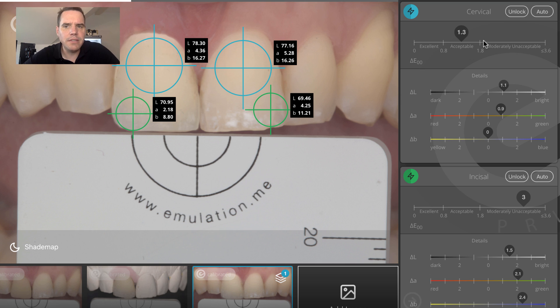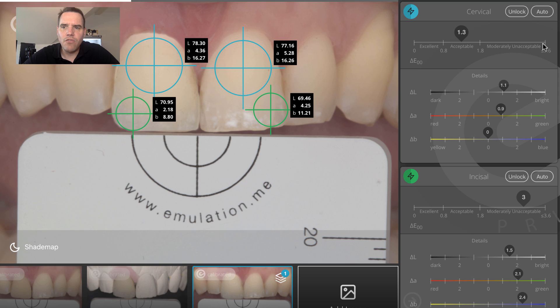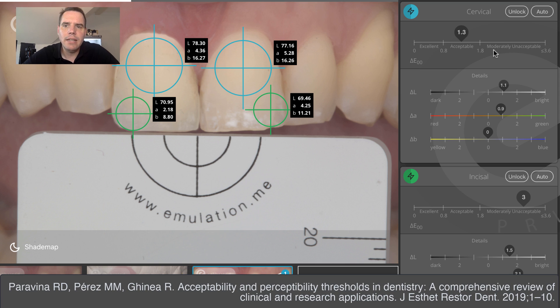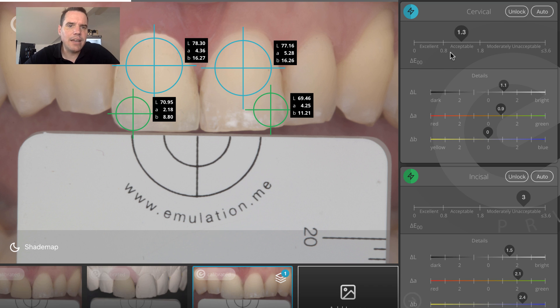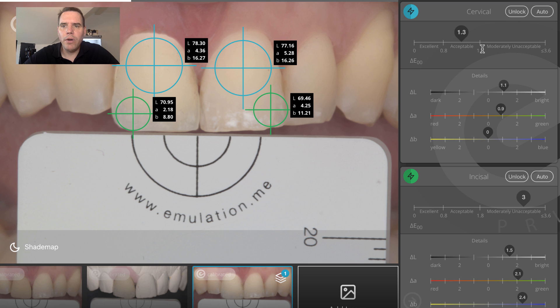We use a ranking scale that comes from clinical dentistry — this was published by Paravina et al. And this ranks the delta E algorithm to clinical relevance. If your delta E value is between 0 and 0.8, then you have an excellent color match — but let me tell you, that's actually quite difficult to get. And if that value is between 0.8 and 1.8, you are well within the range of having a clinically acceptable result.